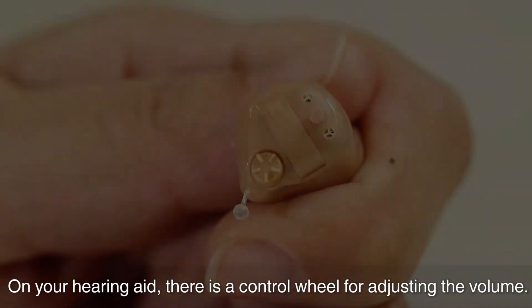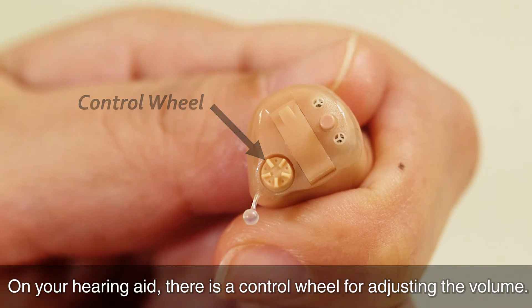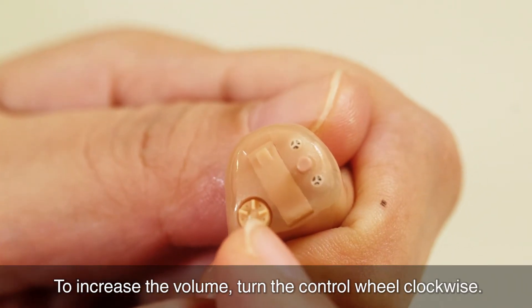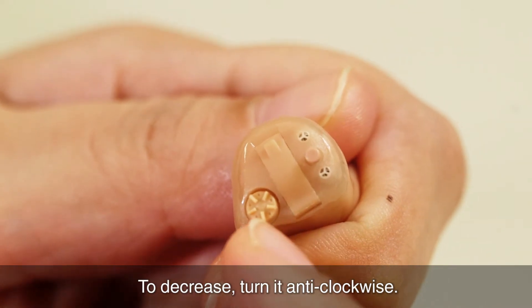On your hearing aid, there is a control wheel for adjusting the volume. To increase the volume, turn the control wheel clockwise. To decrease, turn it anti-clockwise.